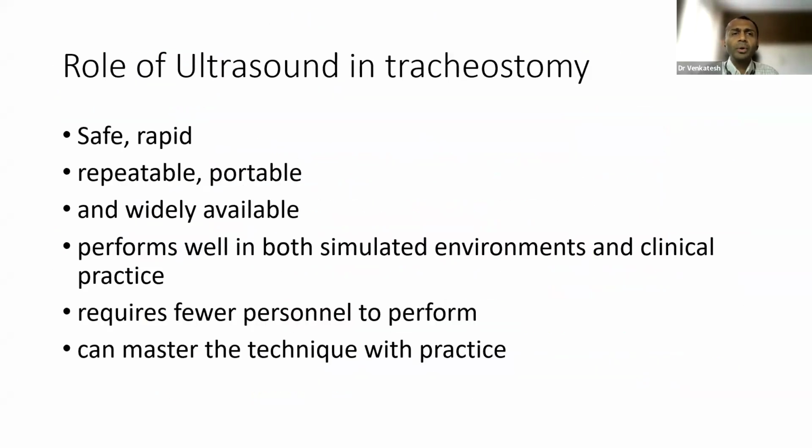So more and more nowadays, ultrasound is being utilized to guide tracheostomy. In the last several years, we have never used bronchoscopy for percutaneous tracheostomy. We always succeeded in utilizing ultrasound, and the more you use it, the easier and faster it becomes. So it is safe, rapid, repeatable, and performs well both in the simulated environment and clinical practice. It requires fewer personnel to perform, and you can master the technique with practice.